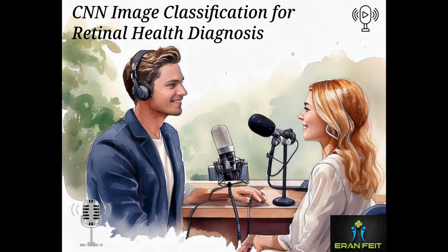So we prepped our images, the learning materials, and we've built the brain, the CNN architecture. Sounds like we're ready to send our AI to med school, right? It's time for the training process. Yep, that's the next step. This is where we actually show the model our labeled images. So the model sees an image and we tell it, okay, this is a CNV or this is a normal retina and so on. The model goes through this process many times in rounds called epochs.